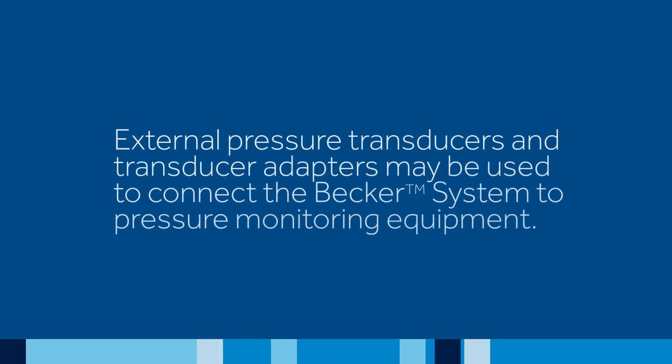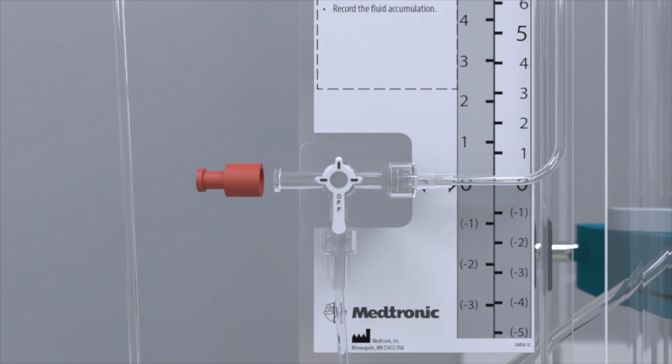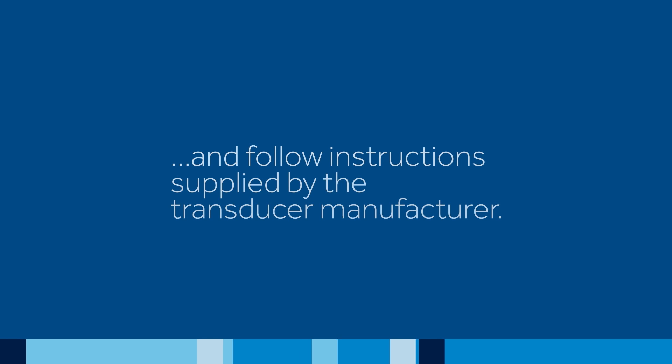External pressure transducers and transducer adapters may be used to connect the Becker system to pressure monitoring equipment. To attach a pressure transducer, remove the red end cap from the main system stopcock and follow instructions supplied by the transducer manufacturer.